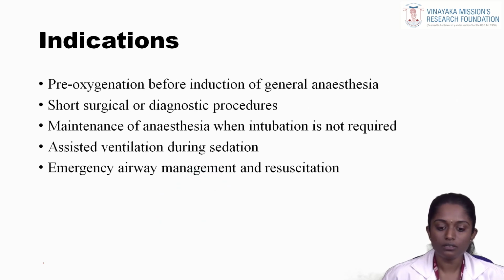Now we will see where we use the face mask, the indications. First we use it for pre-oxygenation before induction of anesthesia. Next for short surgical or diagnostic procedures. Then for maintenance of anesthesia when intubation is not required, where we do not intubate the patient. Just by using a face mask we give the maintenance of anesthesia. Next for assisting ventilation during sedation. Then emergency airway management and resuscitation. These are the indications for the face mask.